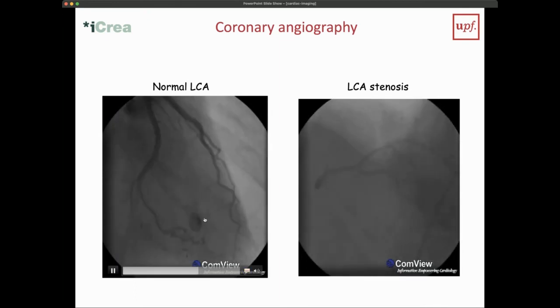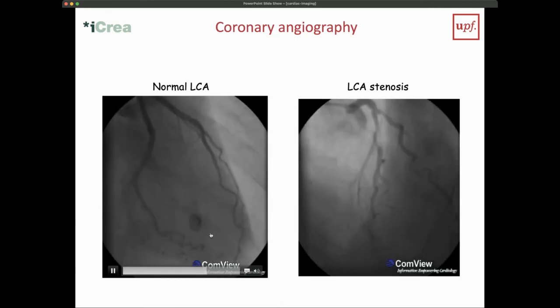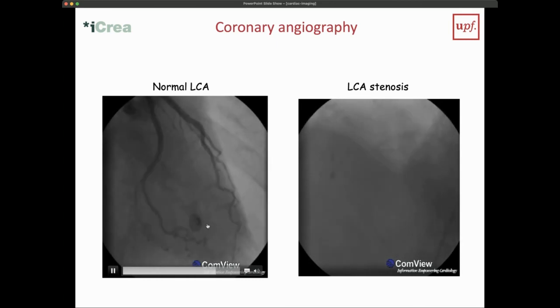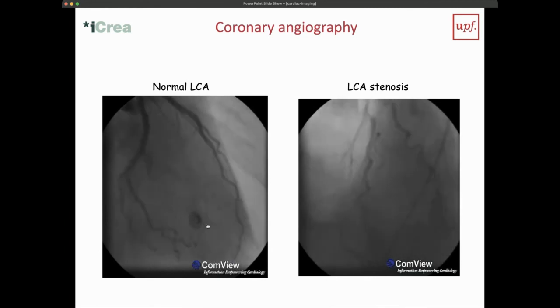And so this way, by reasoning, it's like, okay, what does it look like on X-ray imaging? What type of material would it be then? What's its shape? What are the dynamics? We can actually infer and try to detect what type of structure this is.